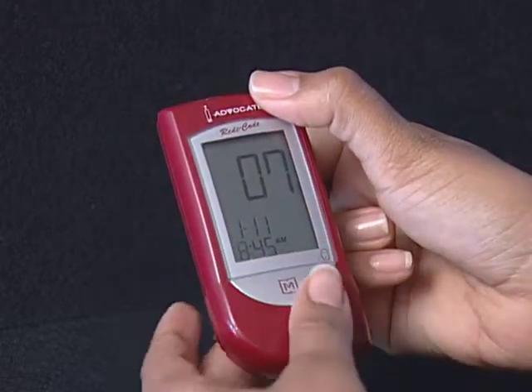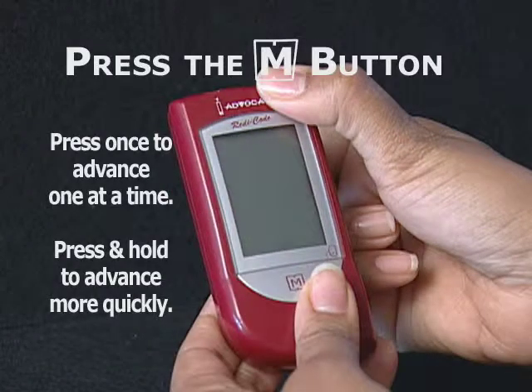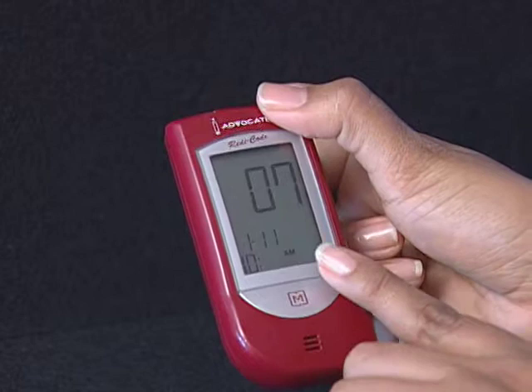Step 4: Set the hour. Press and release the M button to advance one hour. To move faster, hold the M button down. With the correct hour on display, press the Set button and then the minute segment flashes.